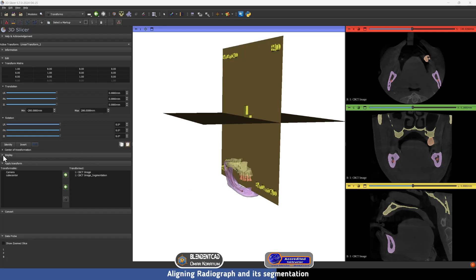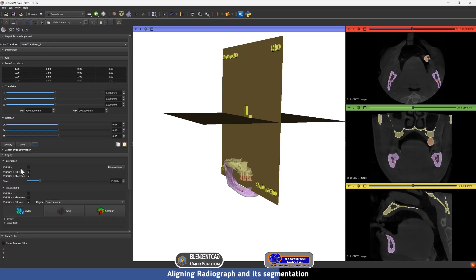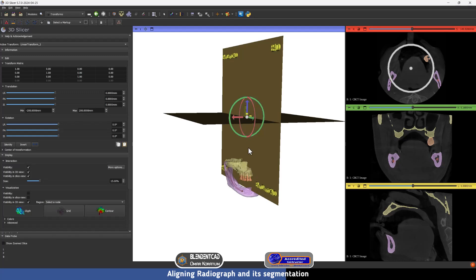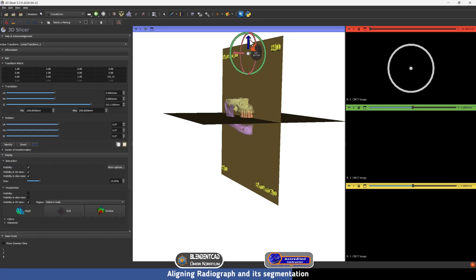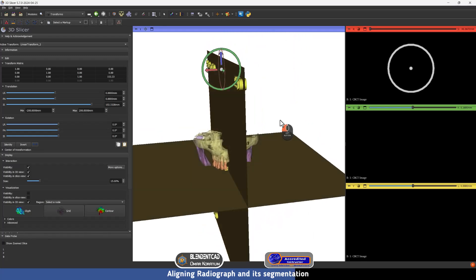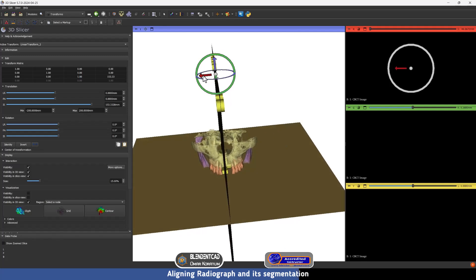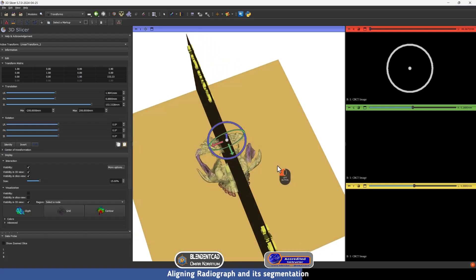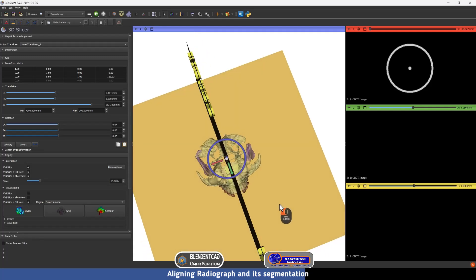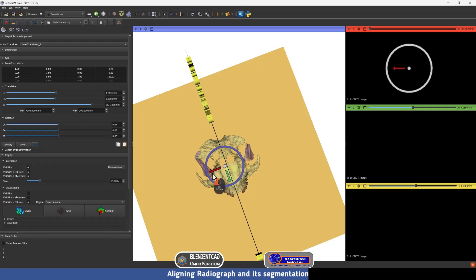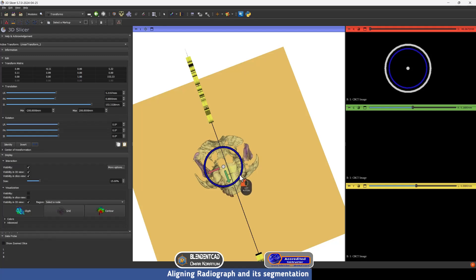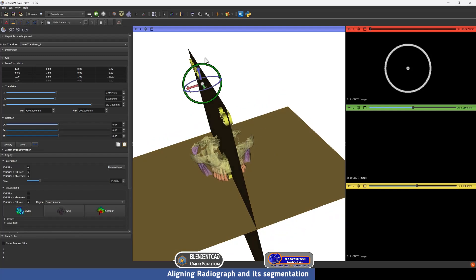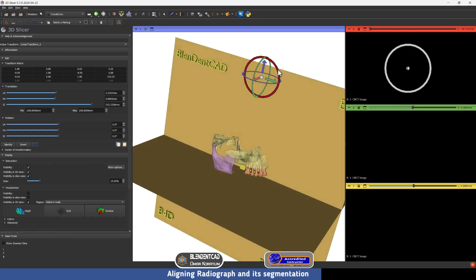We have all these controls to move the radiograph and its segmentation, but an easier way is to click on Display and then under the Interaction menu press Visibility. Now we have a transform gizmo. I'm going to move the radiograph upward by pressing the blue arrow, then move it in the X-axis using the red arrow. We can also rotate using the circles around it — rotate in the Z-axis with the blue circle, the Y-axis with the green circle, and the X-axis with the red circle.